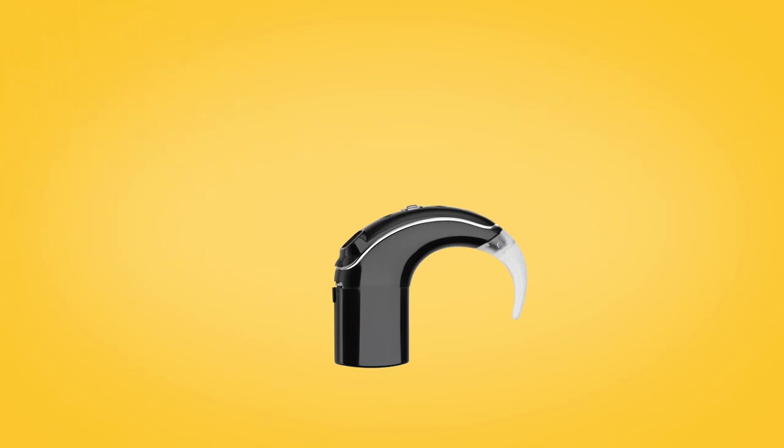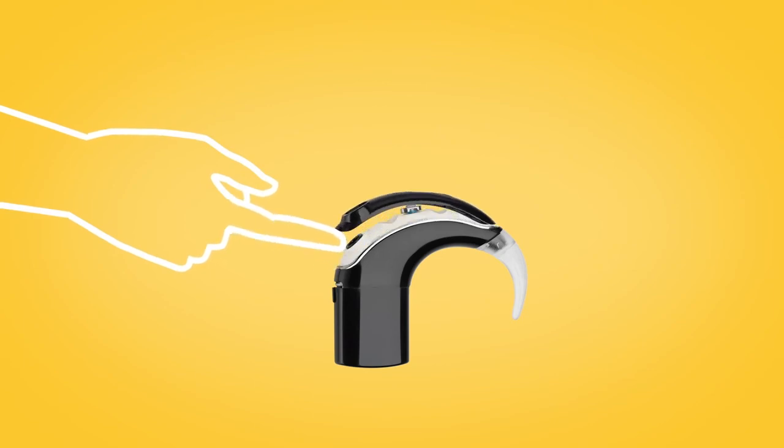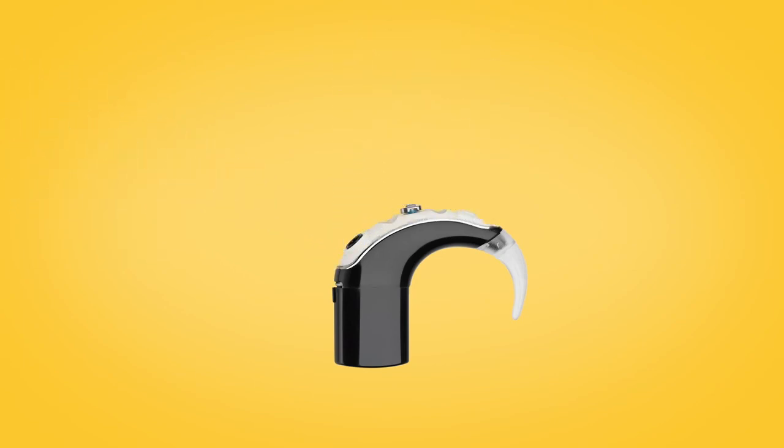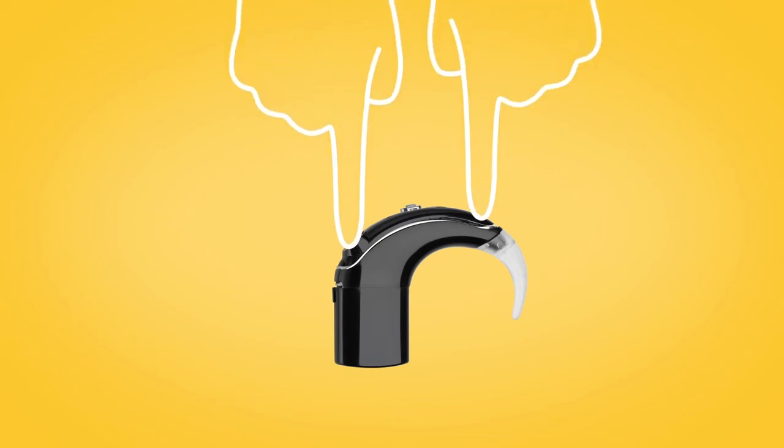To remove the microphone cover, use your fingernail to lift it from the bottom edge. To insert the new microphone cover, fit the replacement onto the sound processor and press down firmly with a finger on each end until you feel a click.